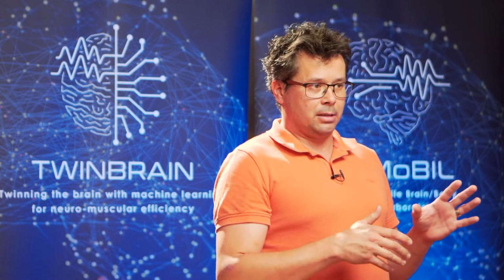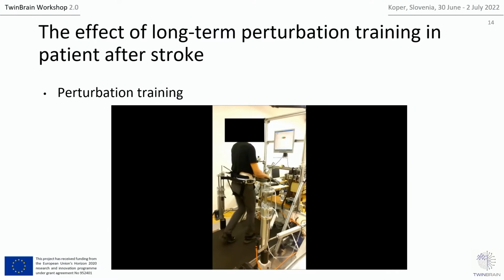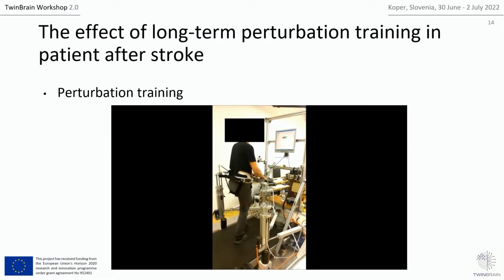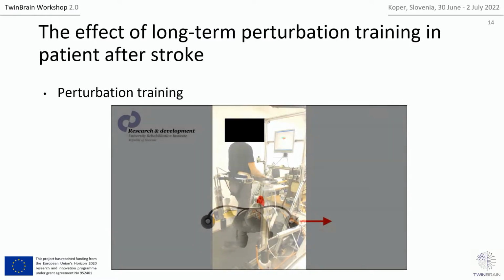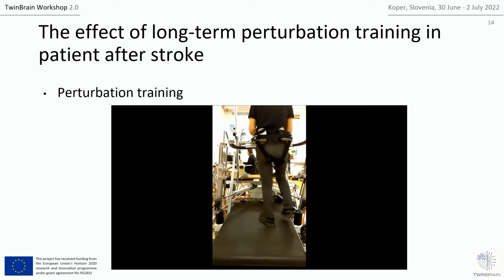So we only have one of these devices. This device is stationary and it's quite bulky, so it cannot be shifted even to another room. So all the training was done here. The patient was coming in 3 times a week and spent approximately 1 hour with us, training during that period of time.